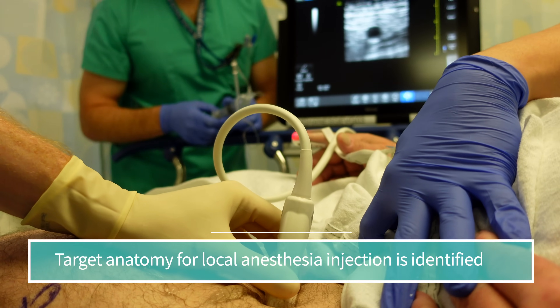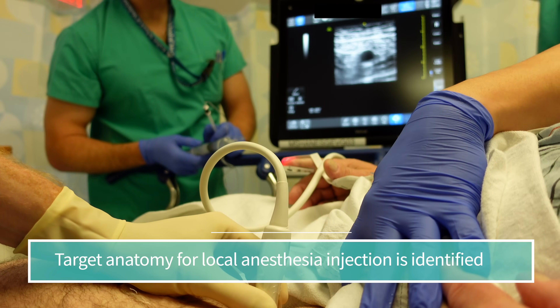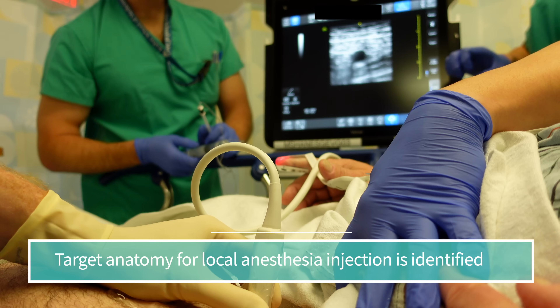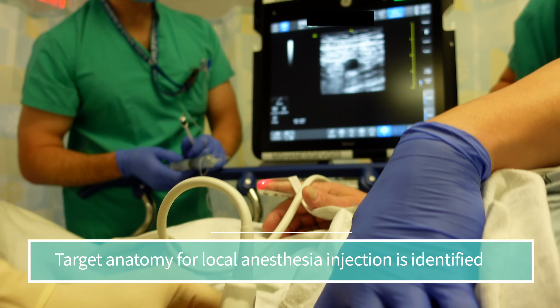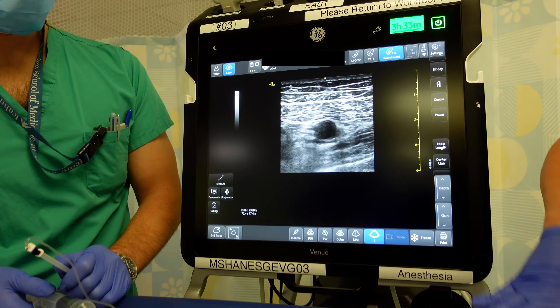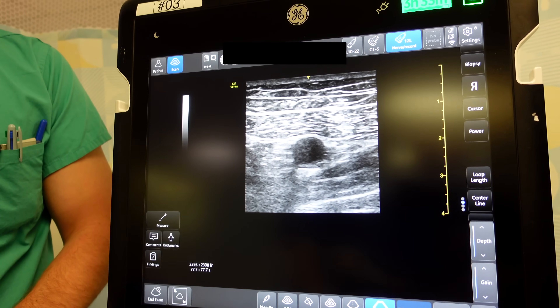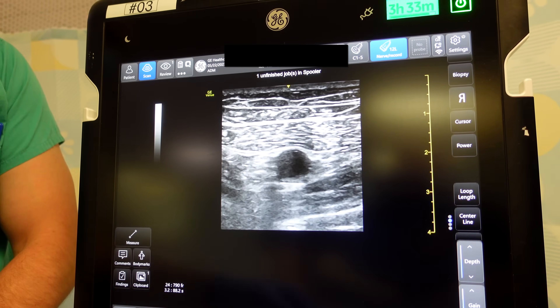That's the sartorius muscle right there, and then right underneath that is the femoral artery and the saphenous nerve, which is the nerve that we really want to block as part of the adductor canal. The saphenous nerve lies somewhere inside this adductor canal, so our job is to inject local anesthetic into that space and block the saphenous nerve and technically the nerve to the vastus medialis.